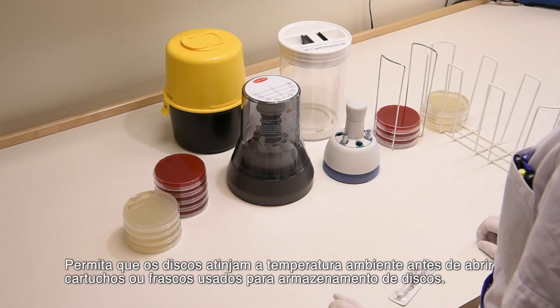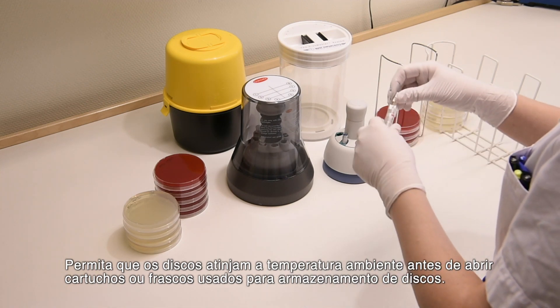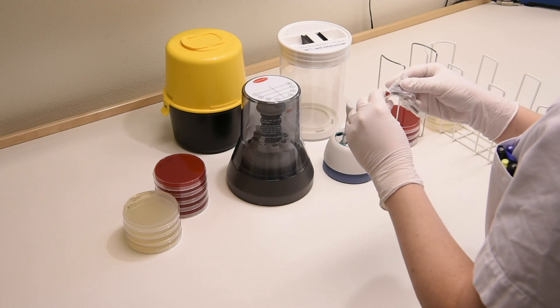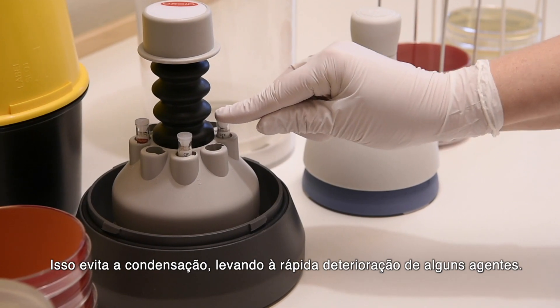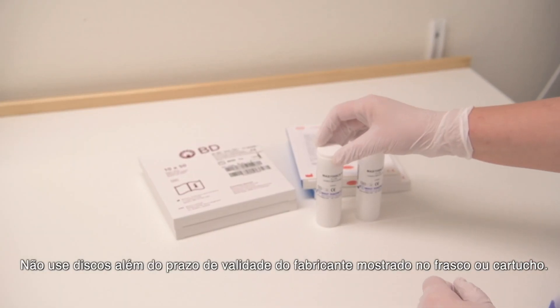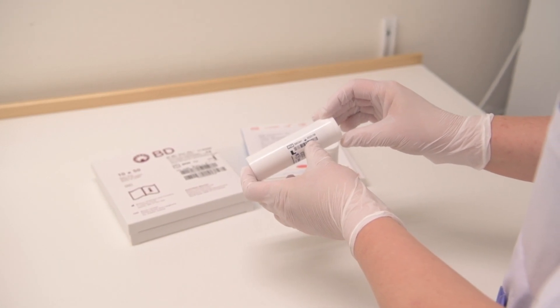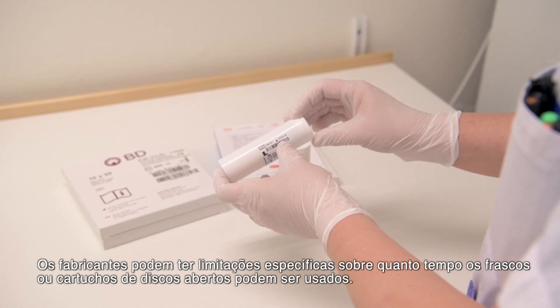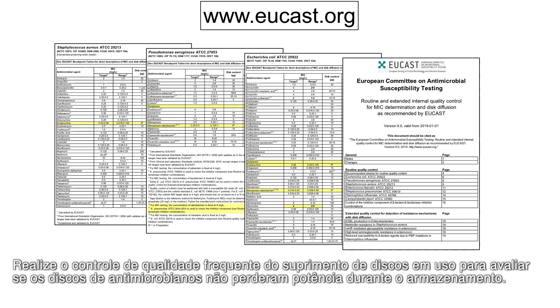Allow discs to reach room temperature before opening cartridges or containers used for disc storage. This is to prevent condensation leading to rapid deterioration of some agents. Do not use discs beyond the manufacturer's expiry date shown on the container. Manufacturers may have specific limitations on how long discs in an open cartridge can be used. Perform frequent quality control of working supplies of discs to ensure that antimicrobial discs have not lost potency during storage.